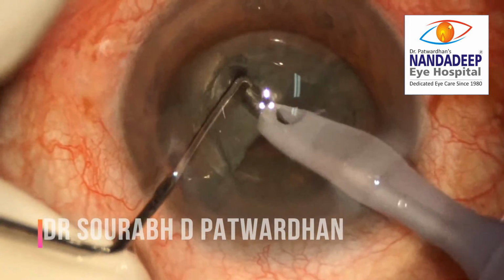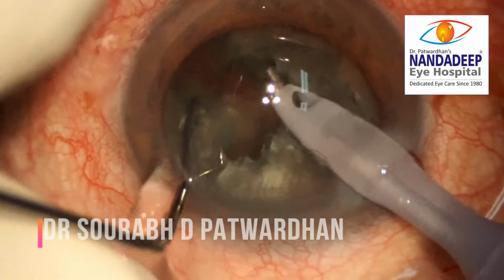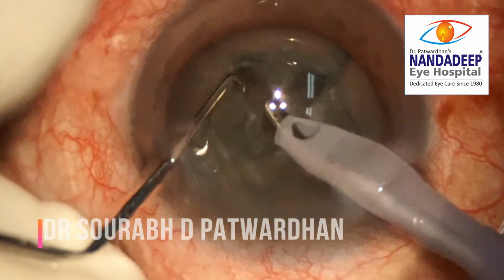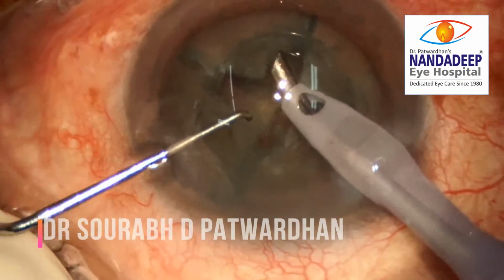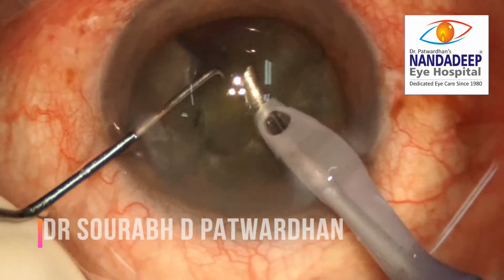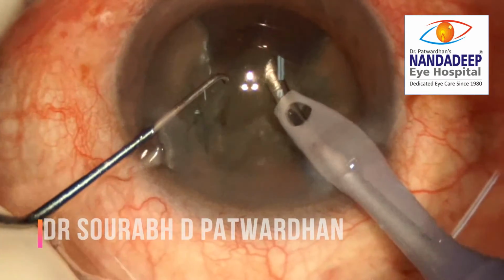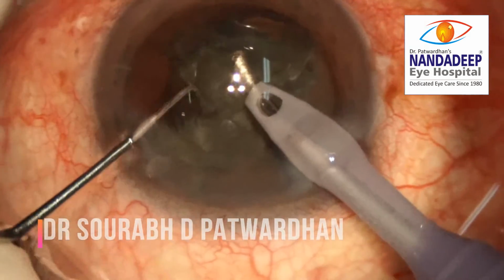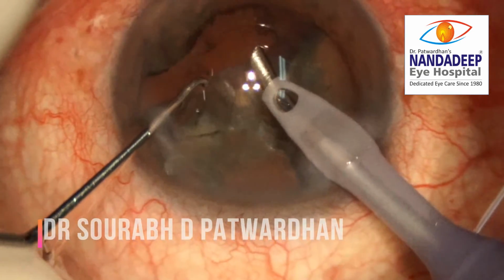Once this kind of leak starts, if you are using low vacuum, then it is fine because still there will not be much of a surge or fluctuation in the antechamber. So I decided that I will just do 4 quadrants using the sculpting because I am using low vacuum. The moment I shift to high vacuum for removal of these chopped or divided pieces, you will immediately find the AC starts fluctuating and it will become riskier for the last piece if I am using a very high vacuum with this kind of wound leak.